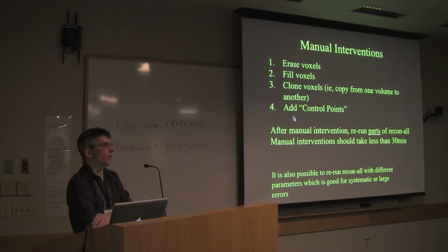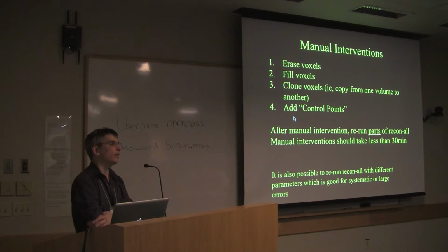And so, it can be a little bit overwhelming as you start looking at these brains and looking at the surfaces and think this will take me forever. And in reality, 30 minutes is oftentimes an overestimate. So most of the time, it probably takes 15 minutes or so. So that's a little bit more reasonable.